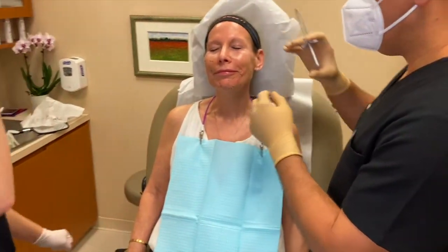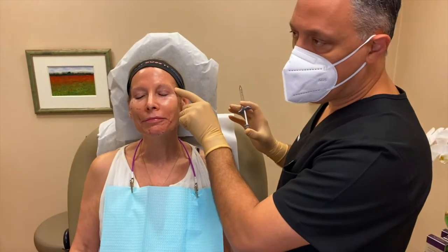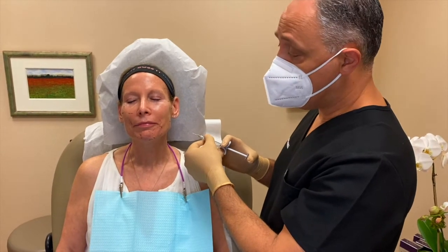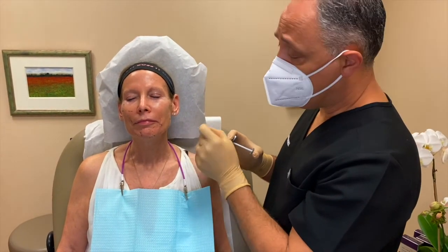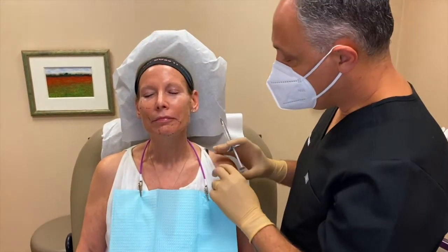All right, excellent. One of the first things to do is to start out by injecting her temples. For this portion, I will use a needle. It's about really proper placement. We want to inject these fillers deep. So here we go. You're going to feel a little pinch, okay?